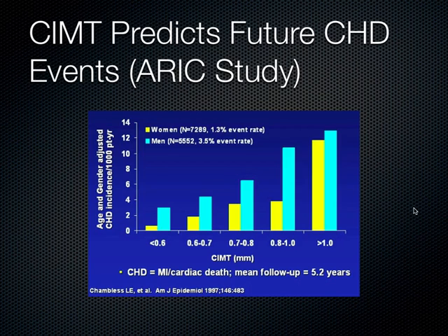And it hasn't really gained a lot of traction because there hasn't been access to ultrasound until very recently. In other words, if you're, let's say, a primary care doctor or a cardiologist, you would have to refer your patient out to get an ultrasound, and then they would come back. And the way this data really works is you do serial ultrasound exams every 3 to 6 months, which really isn't that convenient or feasible to do on a large scale. But they did do it in this study, and they had a lot of patients. You can see the N there is very, very high. It doesn't correlate as well early on in women, but as you get to this larger thickness here, it starts to have a better correlation.